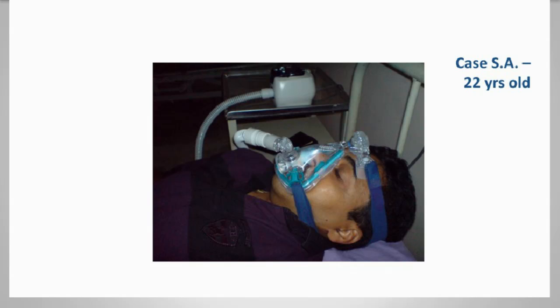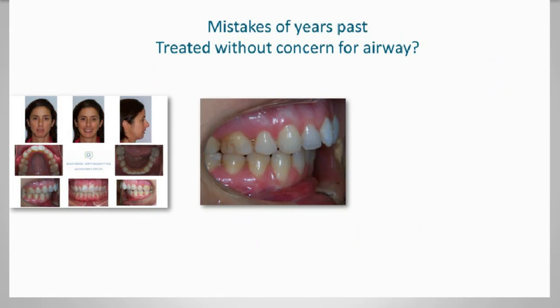Let's take a look at Rosie's case. Another case, had upper premolars removed, sounds like, many years ago by her previous orthodontist. She had upper bicuspids removed for one of 2 reasons: either she didn't have room for her canines, so they took out some premolars for crowding, or to reduce her overjet. Turns out she still has overjet, is missing upper premolars, and has a very small airway.